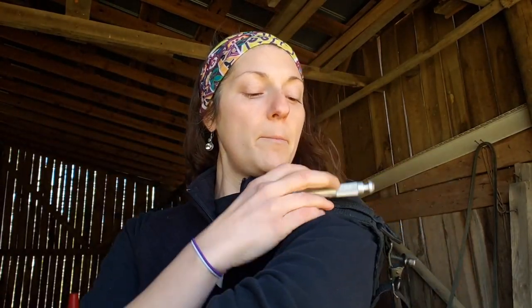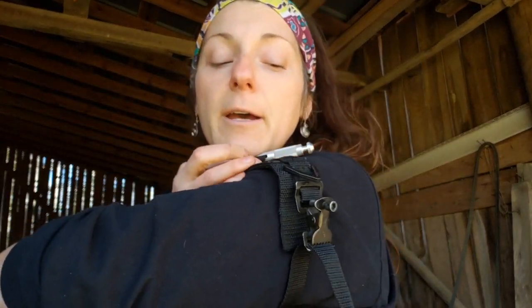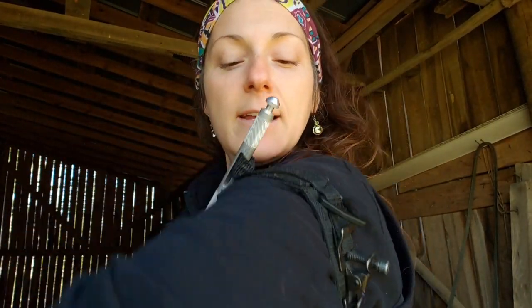When you put your tourniquet on, especially if you're working one-handed, put your windlass on the outside, okay? Take the slack out first. Be very aggressive with taking the slack out. Take it out first, and then with your windlass, you're going to crank.